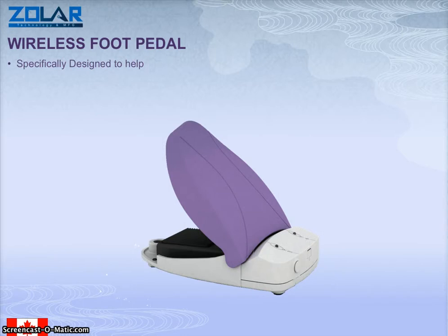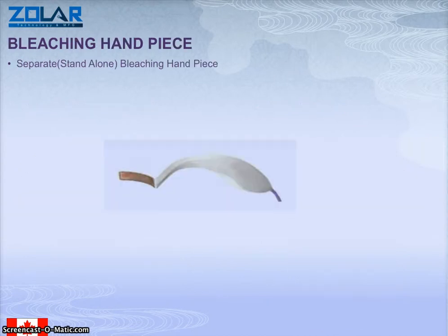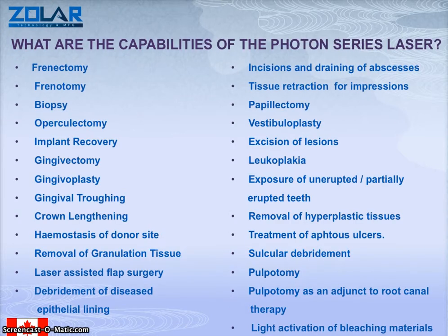The laser comes with a wireless foot pedal. It's designed to help you be very easily mobile. It's got its own safety goggles of course, and you can also order premium glasses for it. The 10 watt laser has a bleaching handpiece — a separate standalone bleaching handpiece. It comes with its own carry case, which makes it very portable.